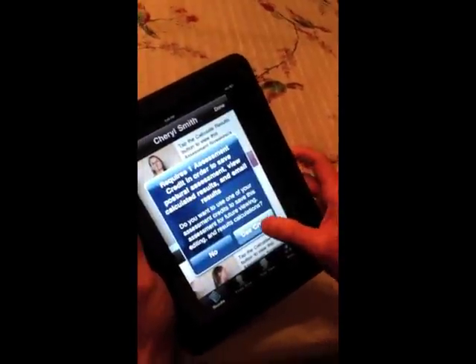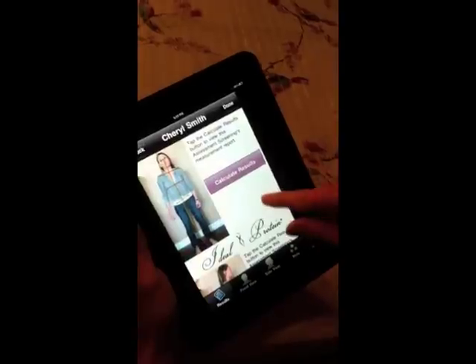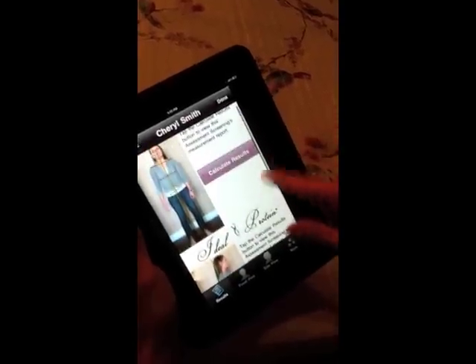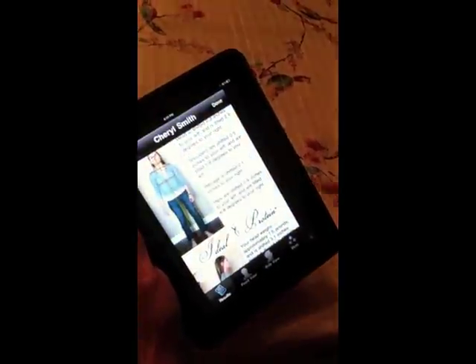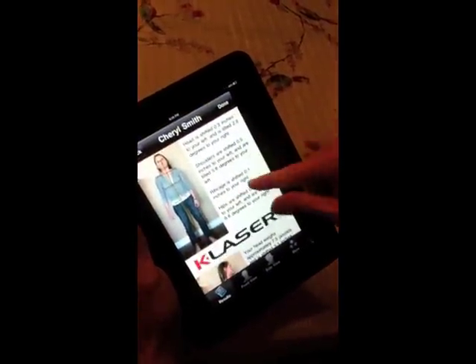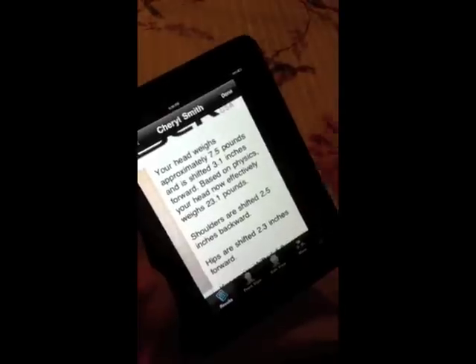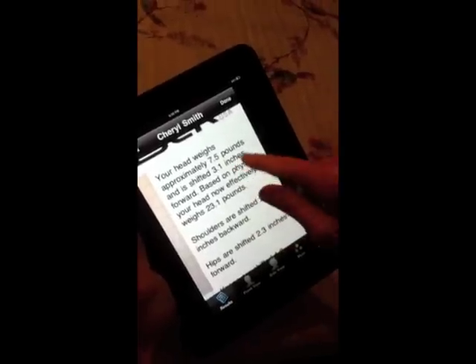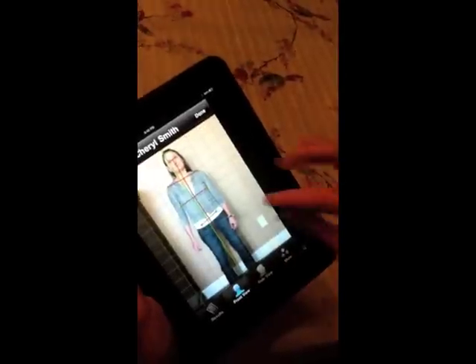We're going to utilize the credit. If you don't want to use the credit you hit 'no,' and you'll get a basic screen you can show patients, but you won't be able to do any of the other assessments. If you want the full assessment, hit 'use the credit' and it calculates all the displacements for the patient. One of the most important is the head weight — her head weighs about 7.5 pounds based on her height and body weight, and it's 3 inches forward, so the effective weight of her head is about 23 pounds.